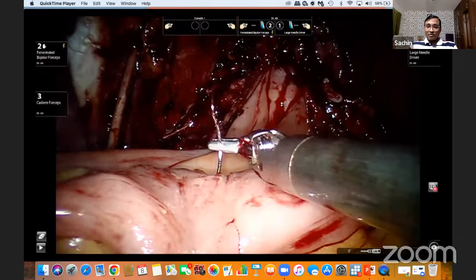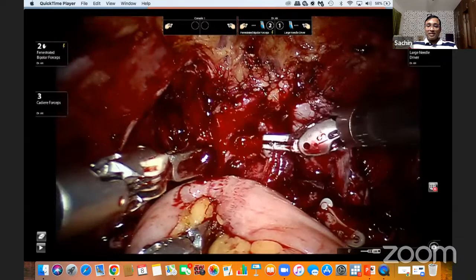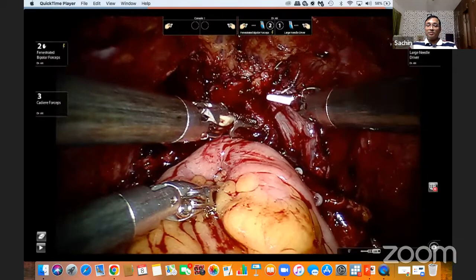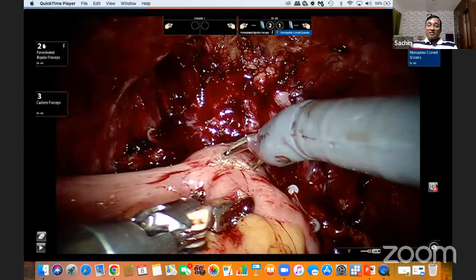With the same stitch which I took, I take a stitch on the posterior wall of the intestine and the rhabdosphincter and try to pull the bowel towards the urethra. This is done before opening the bowel. The anastomosis, all these things are done before opening the bowel. This is outside the urethra, the rhabdosphincter. Not rhabdosphincter, it is rectourethralis.